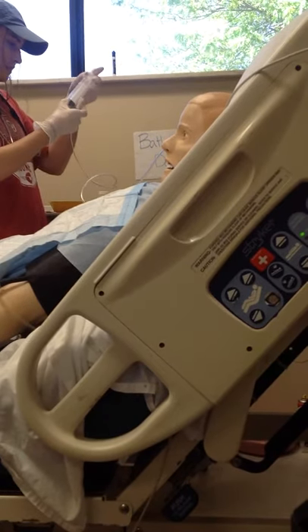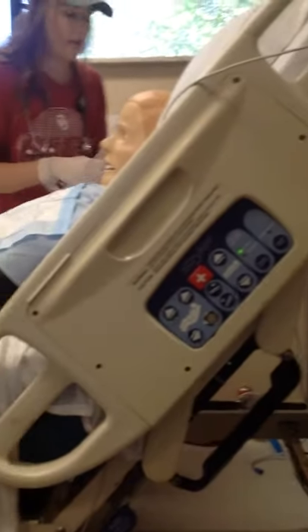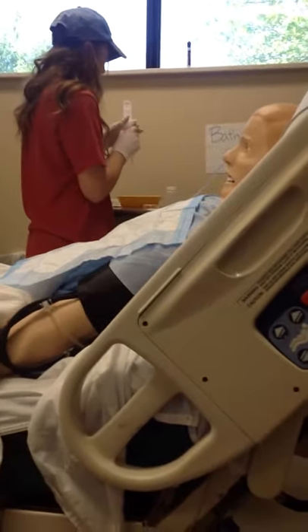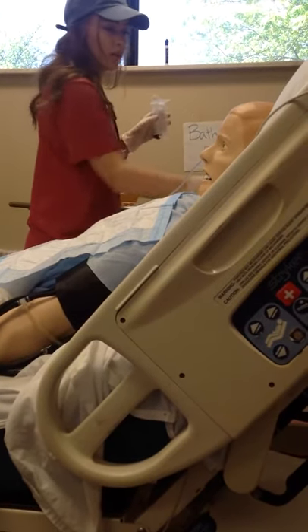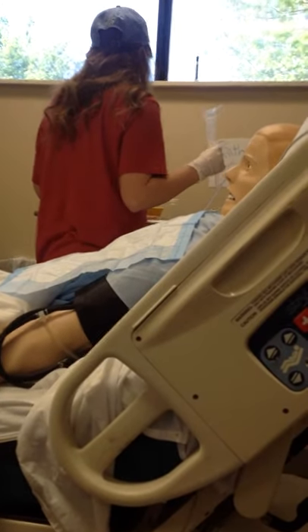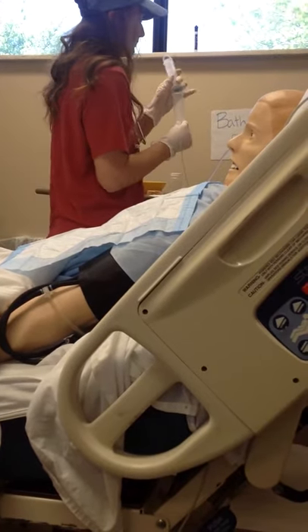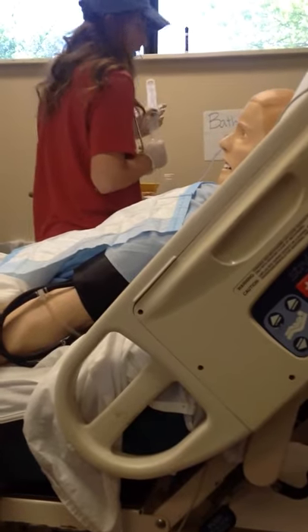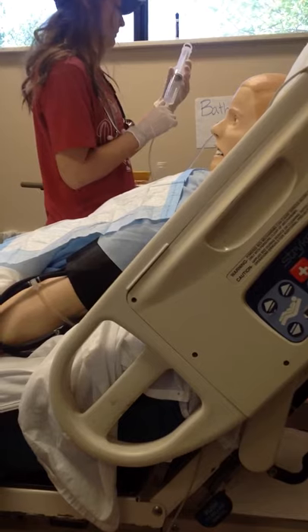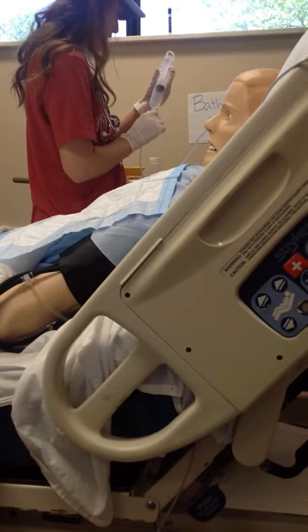So I'm just going to flush with 30 mils of water. So now I'm just going to clamp the tube again, and now we're going to start your feeding. Your order said 60 mils, so I'm going to put the tube in here. I'm going to pour 60 mils of food in and then unclamp the tube so the food can start going down into your stomach. How are you feeling? Pretty good, not hurting too bad. No, I think it's helping a little. It should only take a little bit longer — almost done.